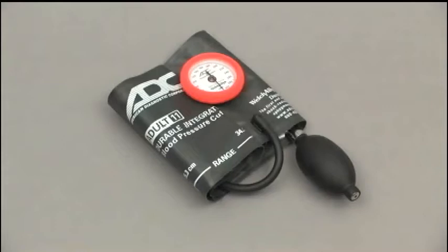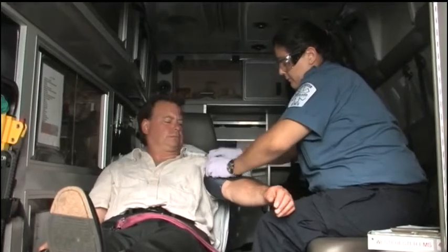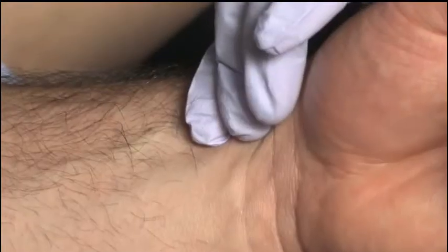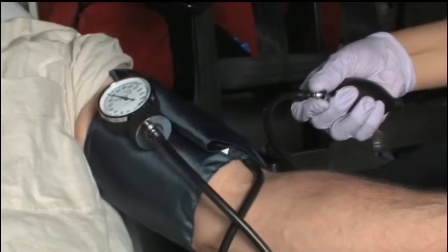When measuring blood pressure, you will use a blood pressure cuff and a gauge called a sphygmomanometer. You can collect readings by auscultating, or listening to the characteristic clicking or thumping sounds with a stethoscope. Or, when the environment is too loud or the Korotkoff sounds too soft, you can palpate the blood pressure, which means to feel the radial or brachial pulse with your fingertips while using the BP cuff.